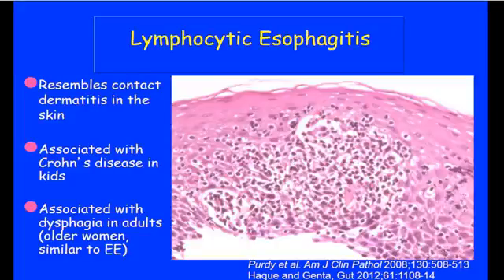But for me, if I see lymphocytes and I see spongiosis together, then I'm much more inclined to make this diagnosis. I think a case like you see here with tons of lymphocytes, it's not a subtle thing, but there are cases where you just see a few lymphocytes here and there, and is that enough in somebody who's presenting with chronic dysphagia? I probably tend to err on the side of mentioning it.